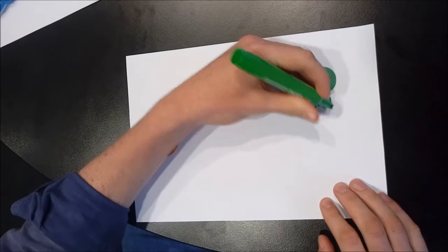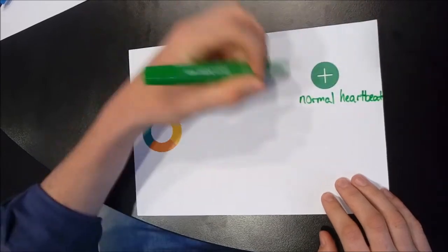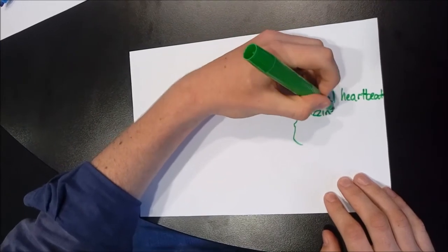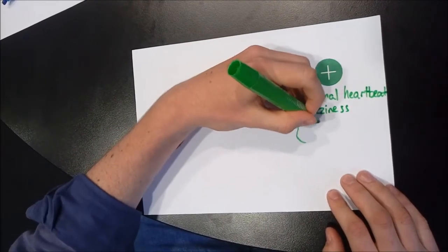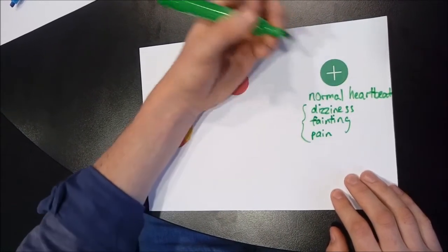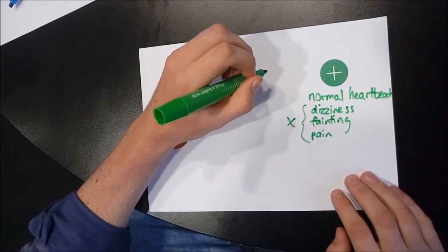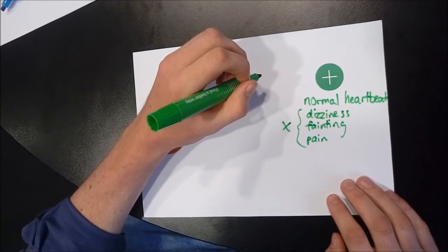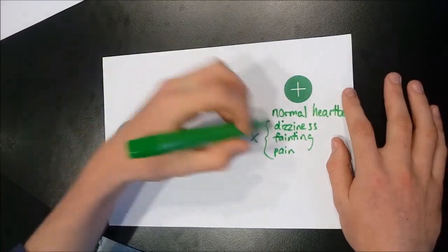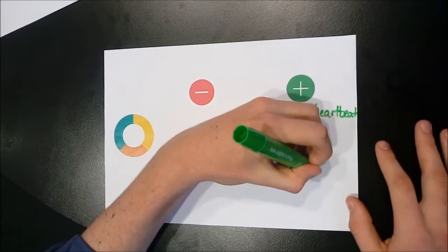With this, the common symptomatic issues associated with these cardiac conditions will be minimized. These basic symptoms include dizziness, fainting, general fatigue, and chest pain. Whilst pacemakers may not necessarily eliminate all these symptoms, many of them will be reduced or altogether alleviated. Due to this, pacemakers can be seen to improve quality of life, especially for patients who wish to remain physically active. Lastly, another major benefit of pacemakers is the reduced mortality rate. One estimate in 2007 claimed that pacemakers reduced hospitalizations by 37% and reduced death rates by 22%.